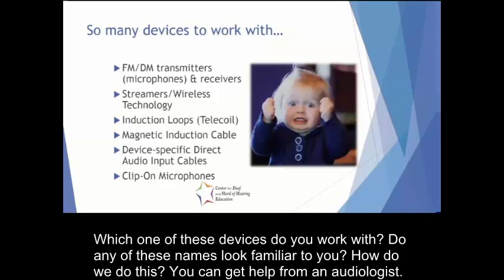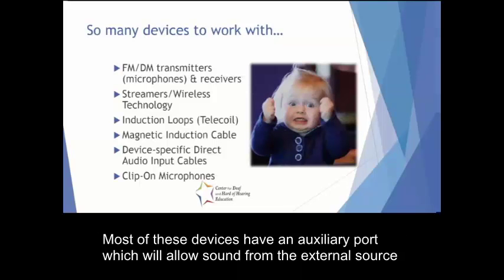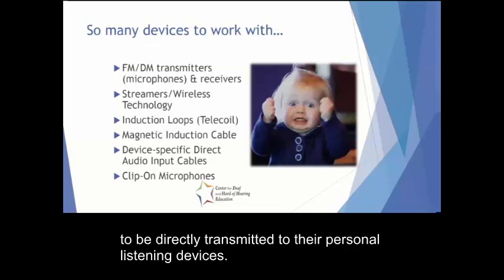Which one of these devices do you work with? Do any of these names look familiar to you? How do we do this? You can get help from an audiologist. Most of these devices have an auxiliary port, which will allow sound from the external source to be directly transmitted to their personal listening devices.